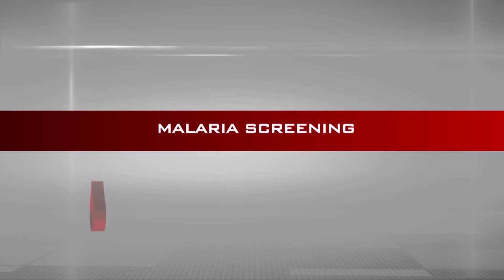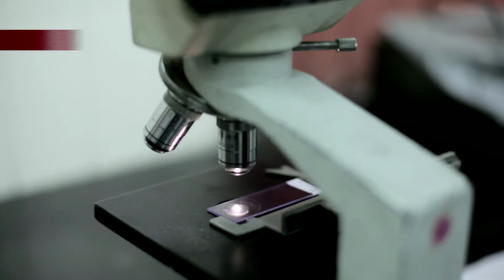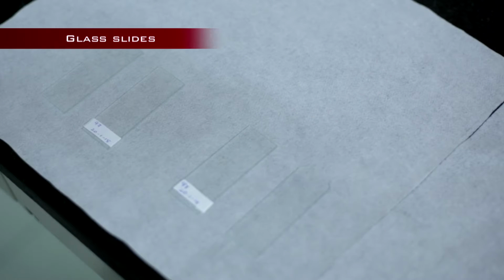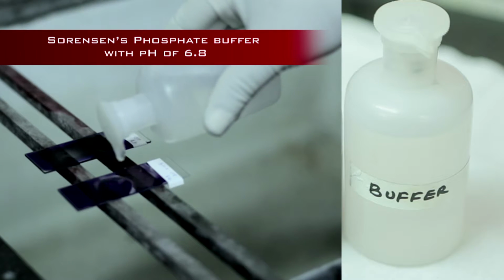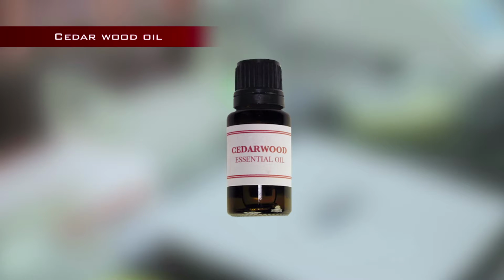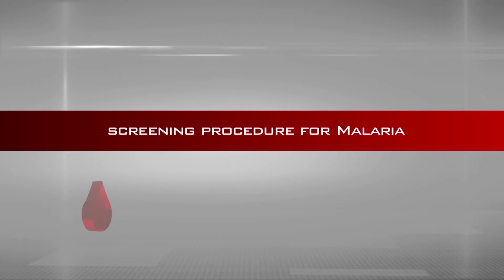Malaria screening. The materials required for malaria screening are microscope, glass slides, Leishman's stain, Sorensen's phosphate buffer with pH of 6.8, cedar wood oil. Now let us move on to the screening procedure for malaria.